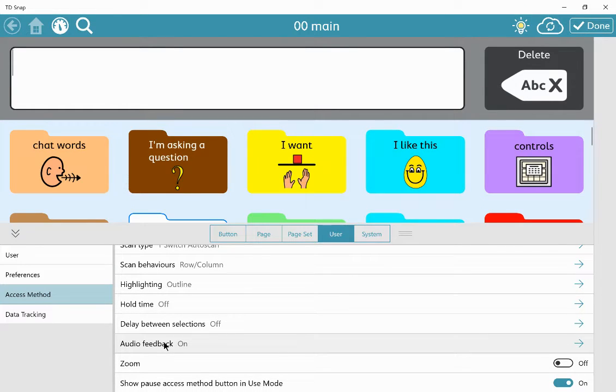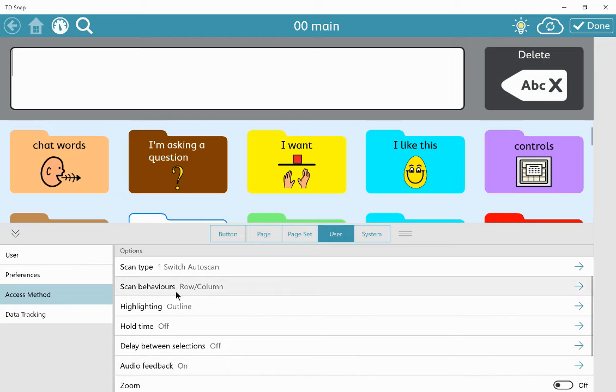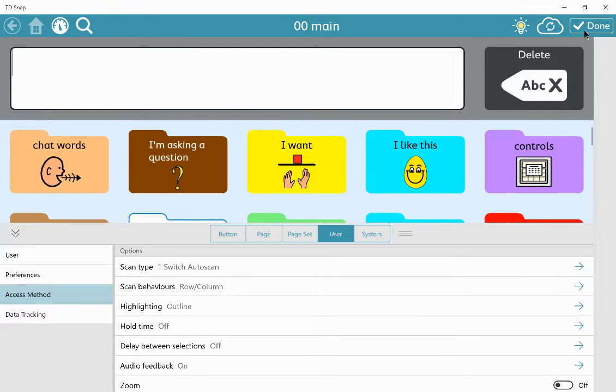And if you're doing something like row column scanning, you'll just hear the first button of the row.